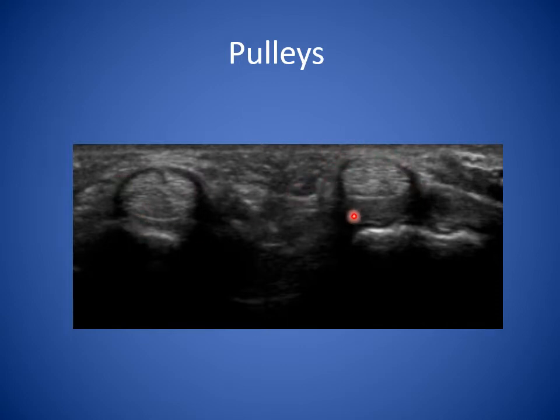I prefer this view where we see both tendons of two adjacent digits in the same TS view. This will help us to distinguish any abnormality in any of them. If we suddenly find loss of fibers here or buckling of fibers on one side, it will be easy for us to pick up the site of the pathology.